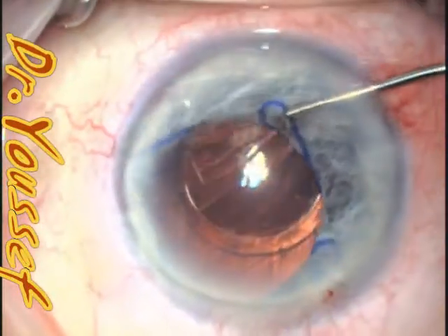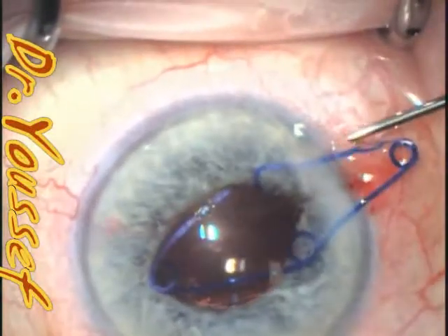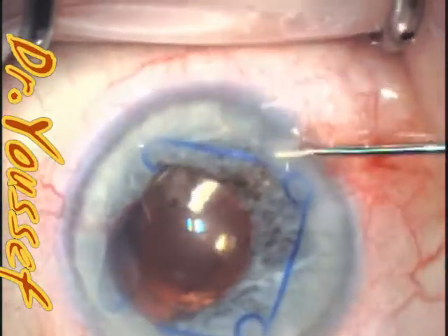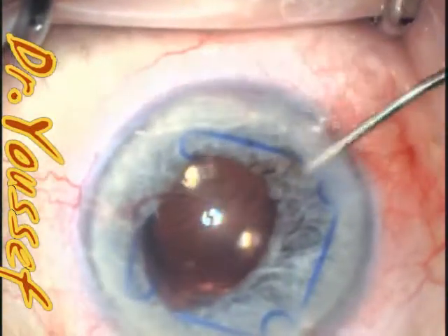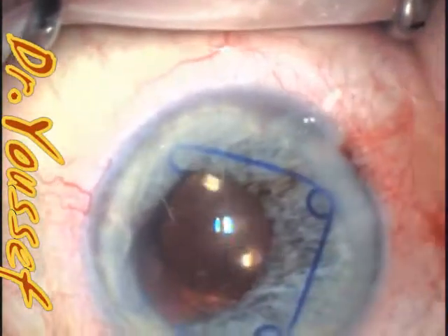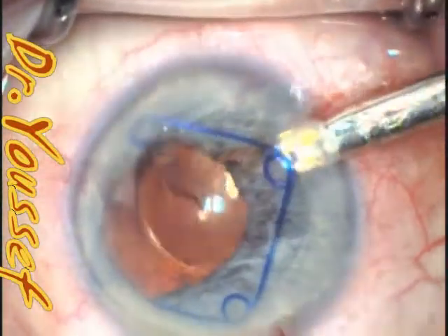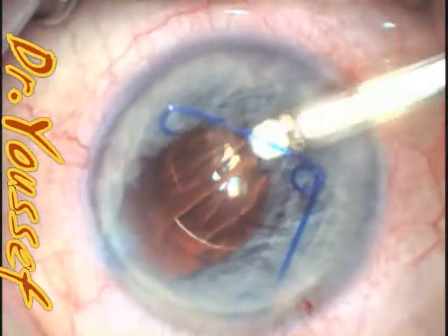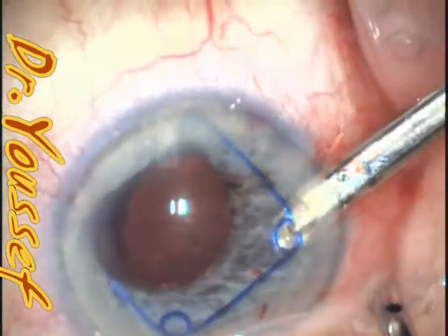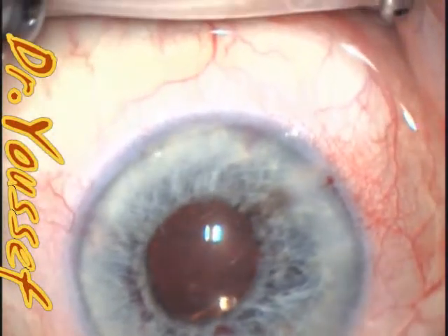Okay. It hooked unintentionally. This wasn't intentional. It hooked the hook and came out with it, which is not good actually, but that's what happened. Now it's in a good position to be taken out. You have to engage both parts of the ring to be able to get it out. Let's see the ring. The hook has to hold both of them. It came out well.